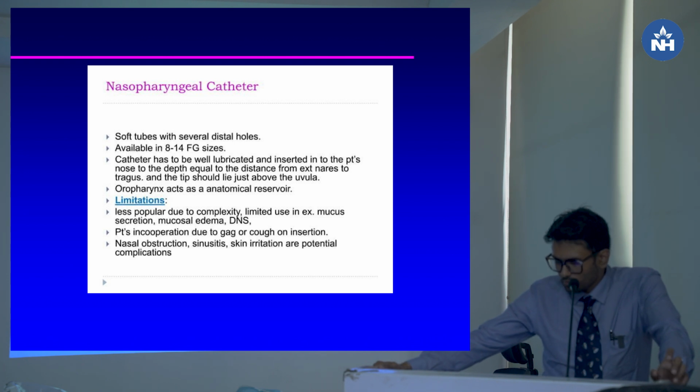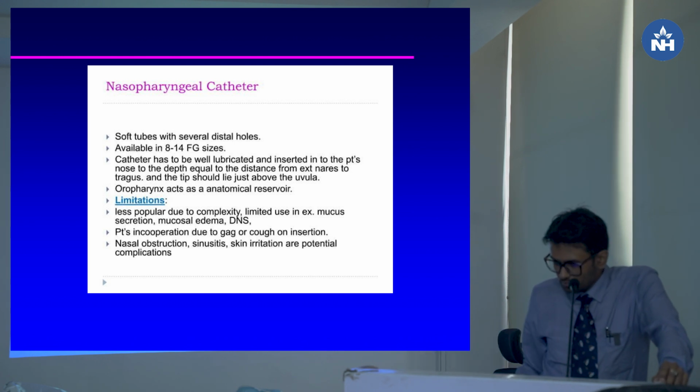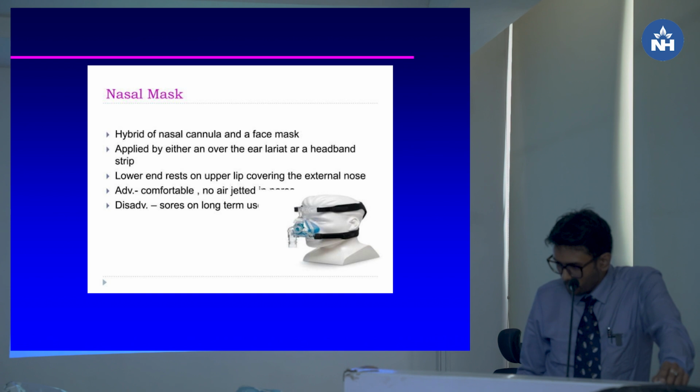Problems: it is less popular due to DNS or any local problem like mucosal edema, and sometimes patient intolerance due to gag or cough on insertion. Nasal obstruction, sinusitis, and skin irritation are potential complications.